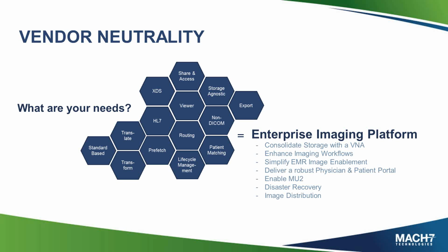And then beyond the access and the viewer piece, how do you share? Some VNA vendors you'll see will have more options around sharing. Some of that sharing being back end through the engine routing, prefetching type workflow, but some of it also being on the front end and sharing not only through CDs and DVDs, but also sharing through emails and encrypted private URLs and time-sensitive URLs and things like that.